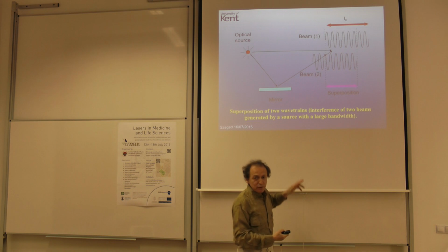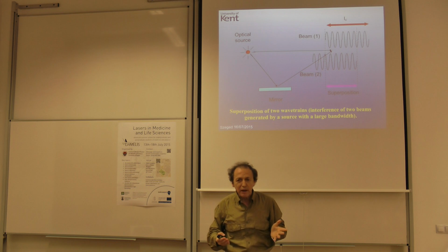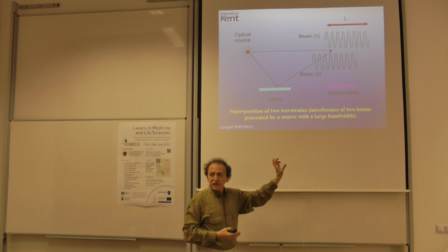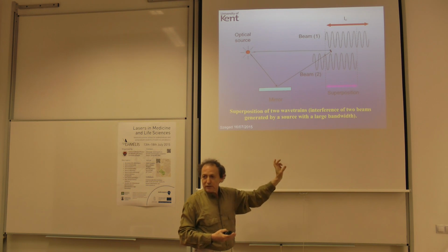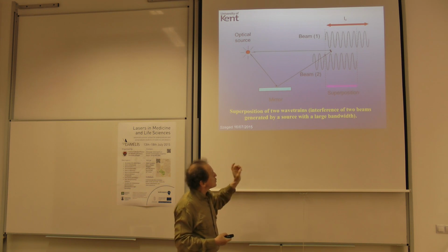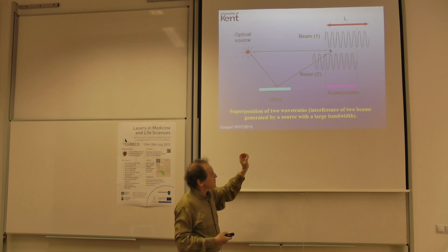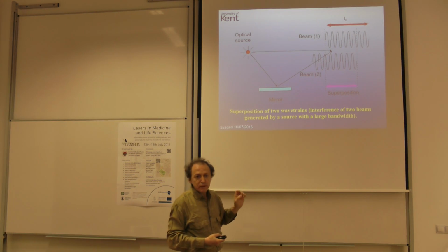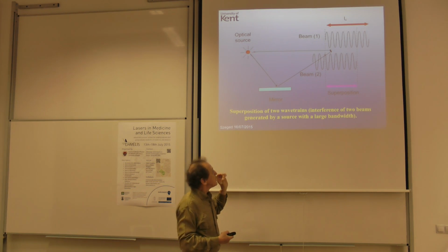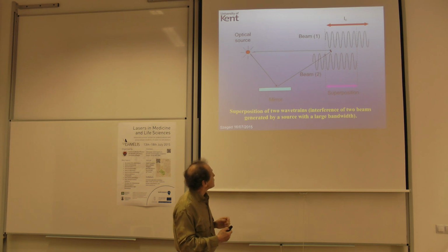So if I delay this even more, the overlap will be even smaller and smaller until there won't be any overlap, no interference. So it's the wave train length which decides when the image is being created. And it's interesting that this sketch shows the operation of both time domain and spectral domain. For instance, in time domain, this sketch will give you the axial resolution, and in spectral domain, this sketch will give you the maximum operational range of the method. And I'll come back to that later.